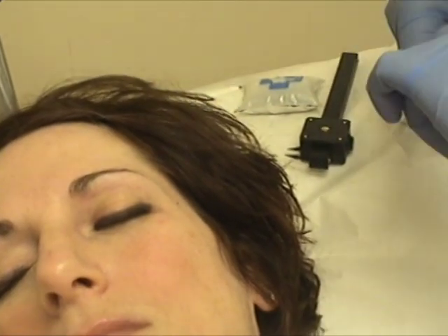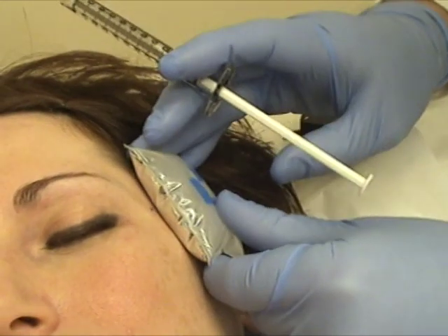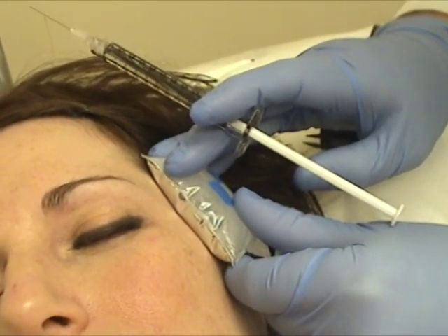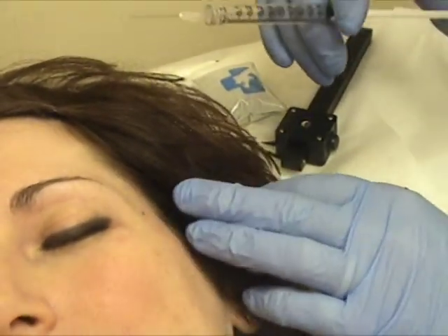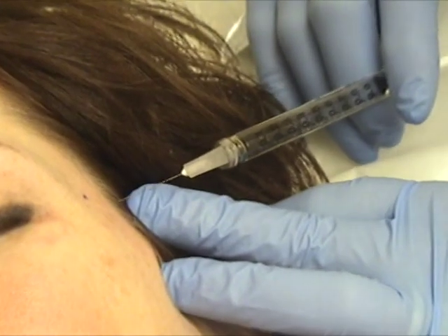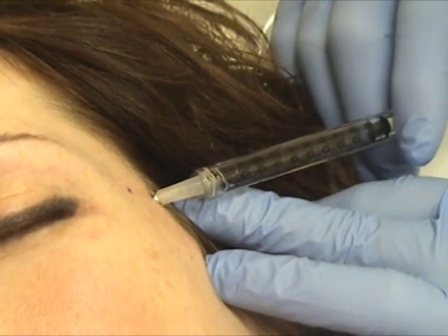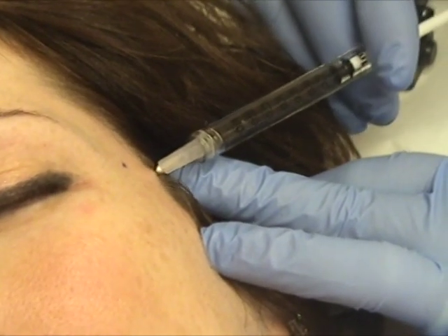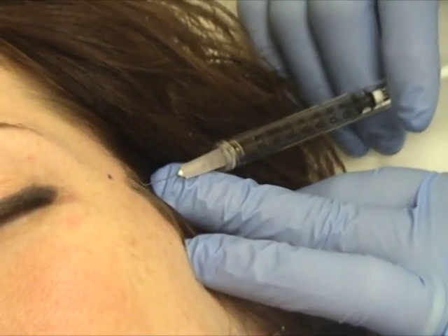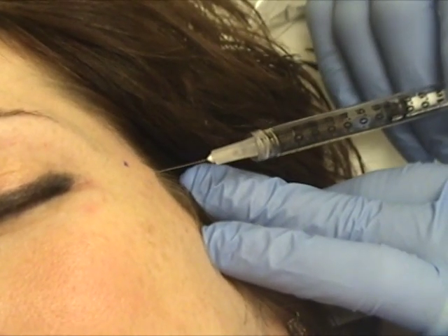We're going to fan this out underneath the nerve into the temporalis muscle. A little poke here — you'll hear the crunches too again. Starting back at the hairline, same needle: 1-inch, 30-gauge. We go all the way down. We're going to try to not inject onto bone, because there's a small communication with the orbital contents, and you can get paralysis of the lateral rectus and get some blurred vision, which I've seen once.